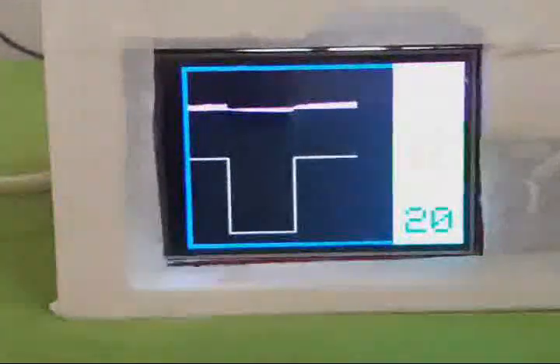He will give you the graph and the value together. And especially, why do we connect this oximeter to this machine? Once the oximeter reads the oxygen level from your body, if your pulse oxygen saturation is less than 90%, he will open the oxygen valve.